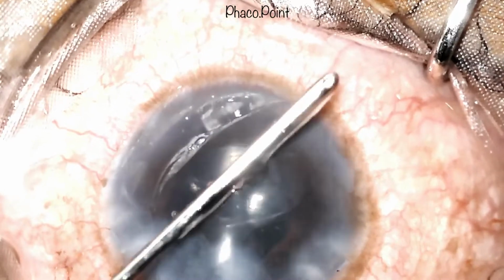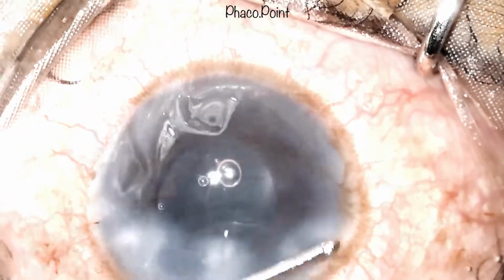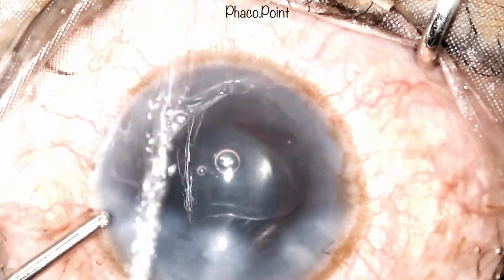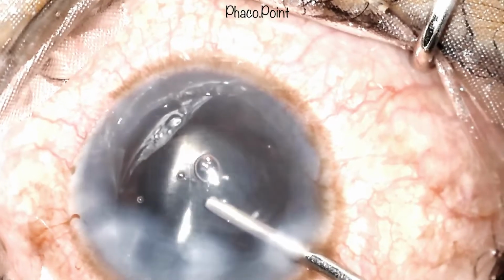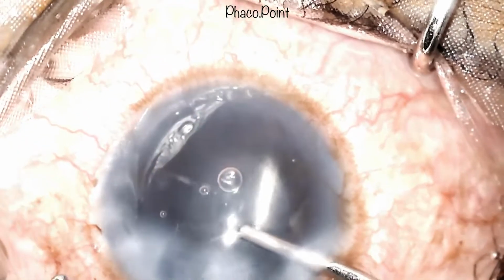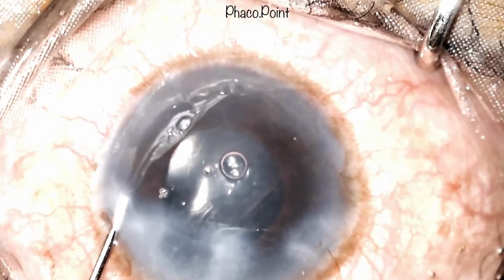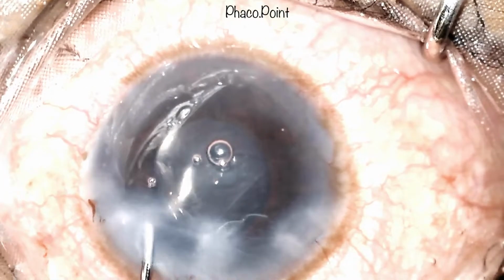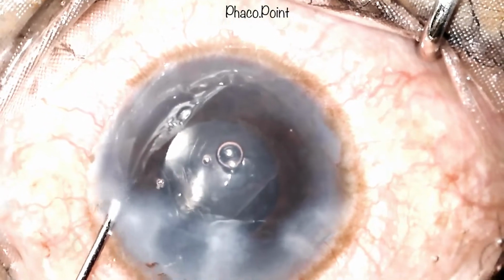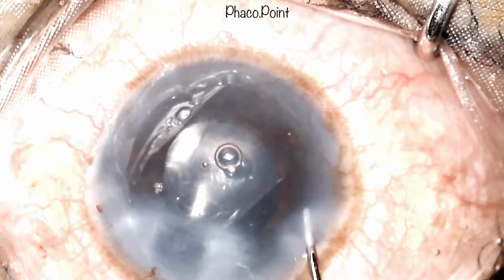You will now see a few maneuvers that are performed which aim at trying to open up the Descemet's to get it to lie against the underlying stroma. These maneuvers include either tapping on the surface of the cornea, either over its center or somewhere towards the periphery, as well as injecting tiny aliquots of fluid through either side port into the anterior chamber, both of which would aim at opening up the Descemet's to get it to lie against the stroma.